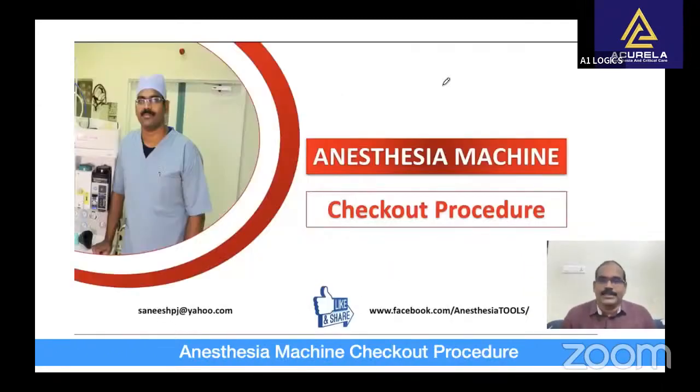In the recent past, it was easier to perform a pre-anesthetic checkout on an anesthesia machine. The machines were not as complicated and the checkout did not differ much from one type of machine to another. There was a list that you could either commit to memory or attach to the machine as a guide, and you had to complete each step similar to an airline pilot's pre-flight checkout.